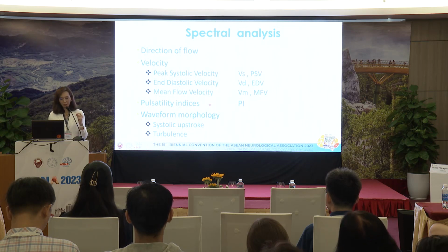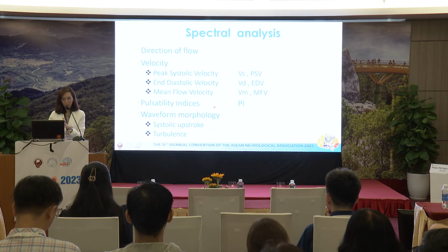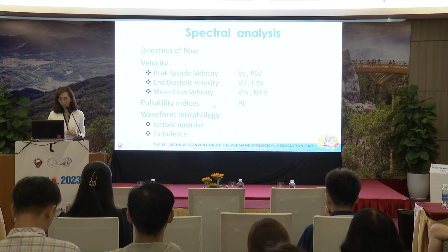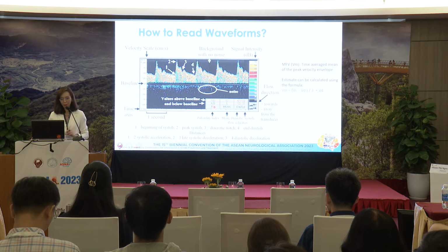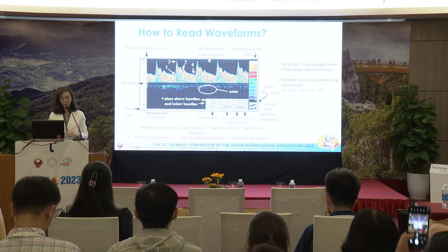And we will look at the pulsatility index. And also we'll look at the waveform morphology. Sometimes there's some turbulent flow, sometimes there'll be a bruit, you'll be hearing something. So these are the analyses that we usually do from TCD. So this is what the waveform looks like. So systolic, diastolic, very simple.